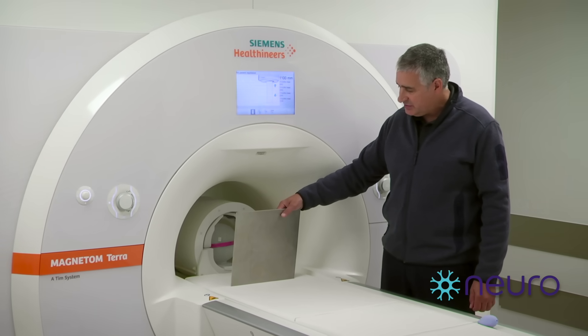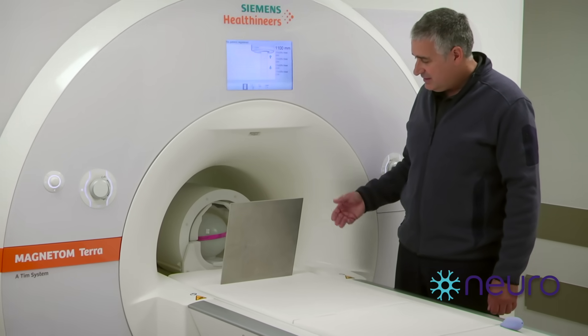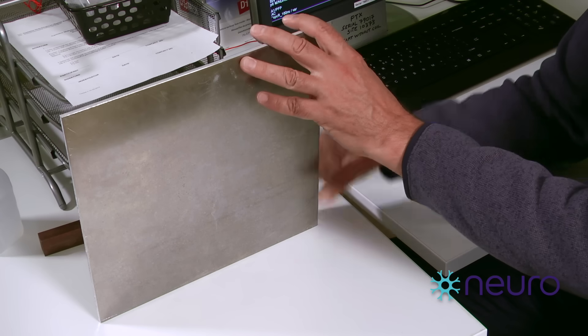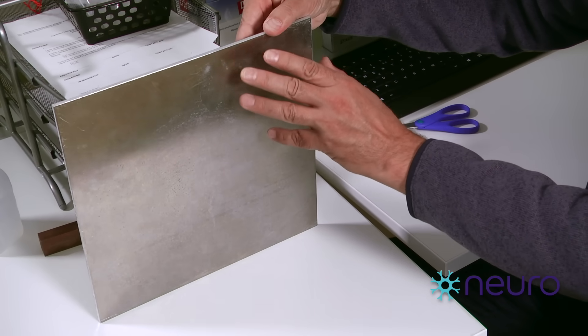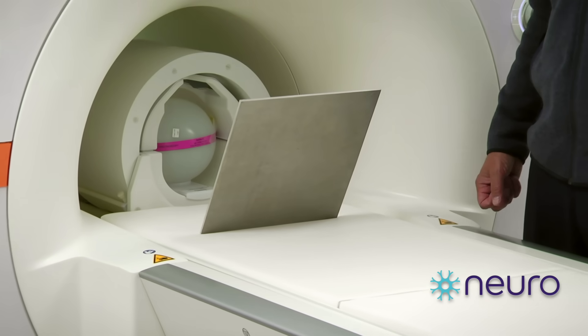Because this aluminum plate is not ferromagnetic, we can safely bring it close to the bore. As you can see, it's not attracted, so it doesn't pose the type of danger that the scissors did in the previous demonstration. We'll let go of the plate, and we'll see that it falls over very slowly, almost like it's suspended in molasses.